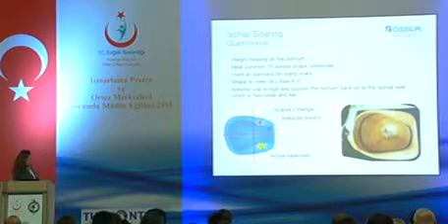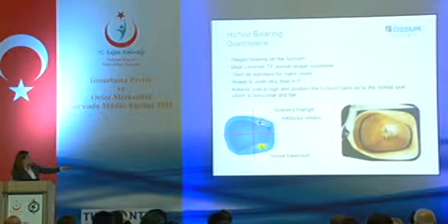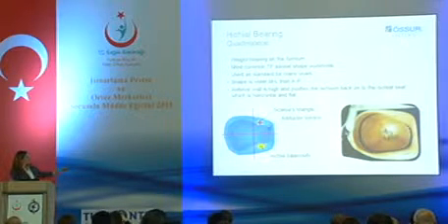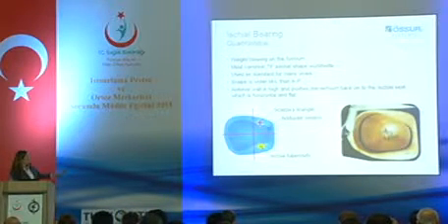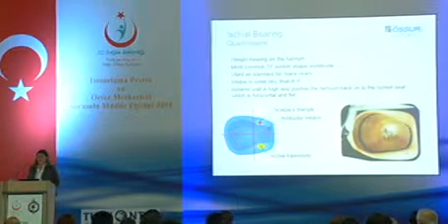So if we look at the picture, there we go. We tend to put some pressure on the Scarpa's triangle, pushing it, putting our trim line higher, making sure that there's space for the adductor tendon, and then it'll push back the ischium to the horizontal and flat seat.